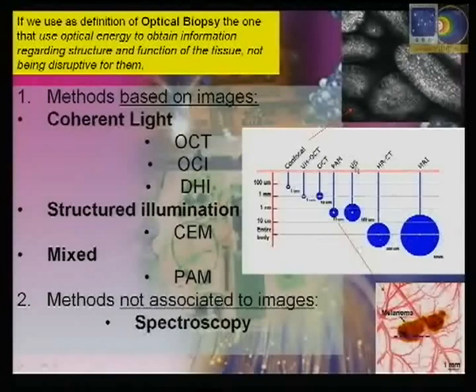but there are applications related with ultrasound, and this is the PAM, the photoacoustic microscopy, which has a very good penetration. A very good penetration means 3 to 5 centimeters in the body. But obviously, the lateral resolution is less, although it's very good, because 15 microns is a very good resolution.